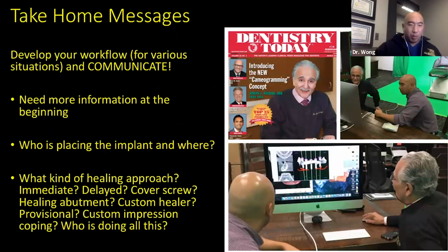Who's making the custom impression coping? So who's doing any and all of these steps? And it's really important to know this, right? Because these steps, as I've shown you today, are very critical in getting a nice final restoration for the patient. And if you don't know how to do it, ask questions, learn how to do it. I don't think in the last 54 minutes that I've been talking that I've shown you anything that you can't do on the restorative aspect. Very, very minor details.